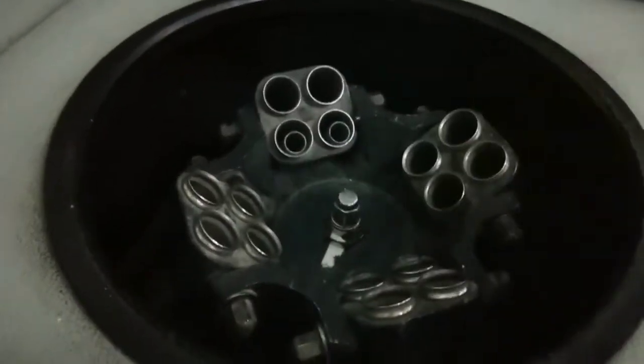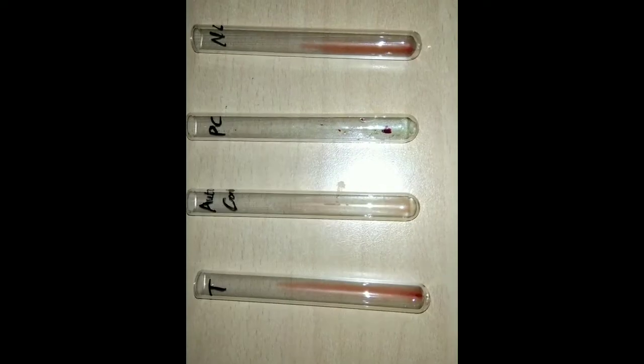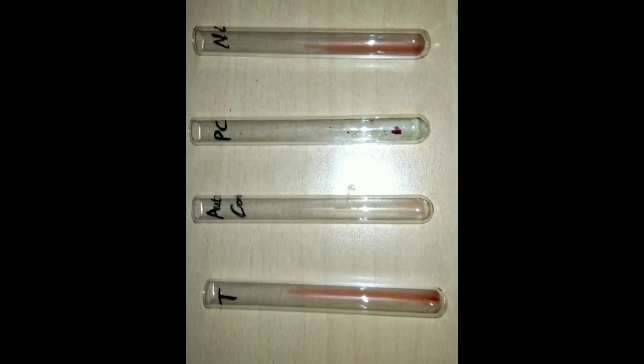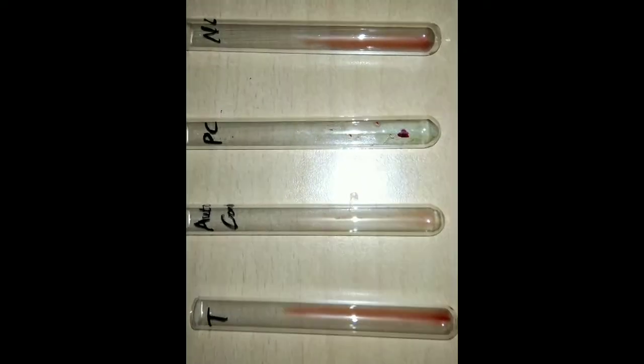Centrifuge the tubes at 1000 RPM for one minute. After centrifugation, look for agglutination. There is no agglutination seen in the test tube, auto control tube, and negative control tube. There is agglutination seen in the positive control tube.